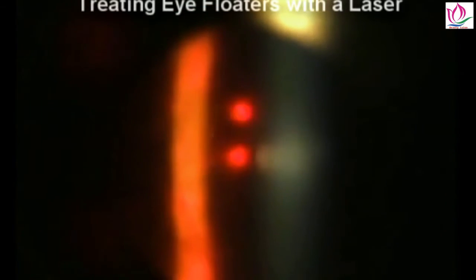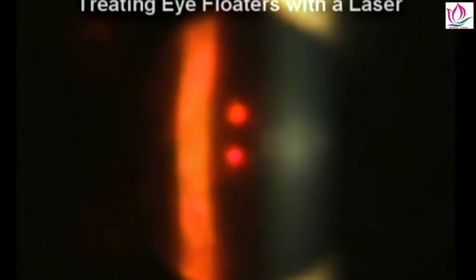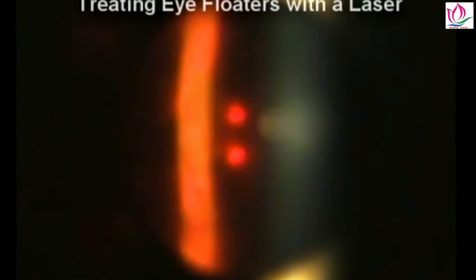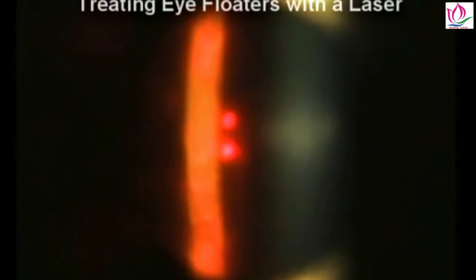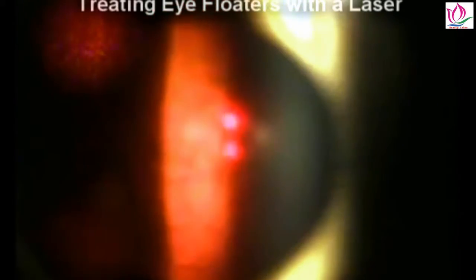And in a moment, I'm going to do a wider scan, and we're going to scan the quadrants here to show you that that floater that was there 20 or 30 minutes ago is essentially not there. This is, I think, a strong argument and good evidence that when some people say that the laser just breaks the floater up into smaller pieces, and so you're left with a lot of small pieces. Well, if you look around here, as I'm doing with this lens, scanning back and forth in all the different quadrants of that sphere, that ring is just not there. That floater material is just not there.